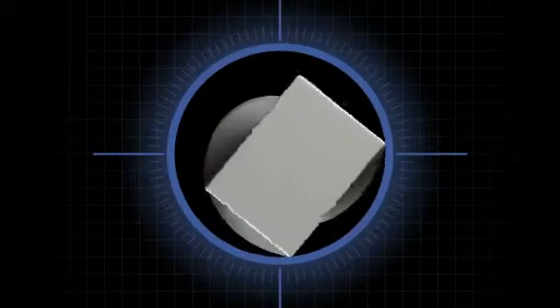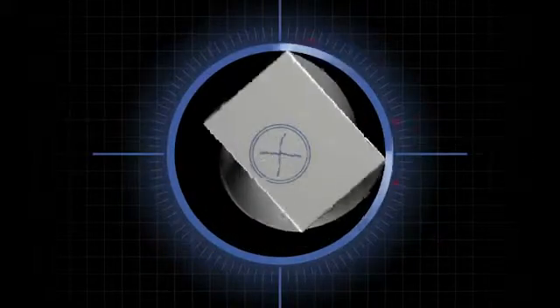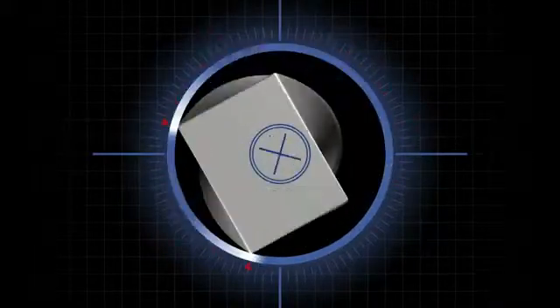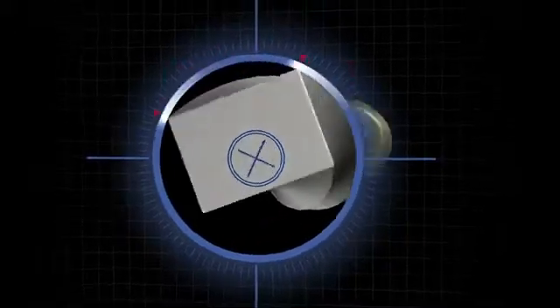Here is a closer look at the unique offset rectangular cross-section. Notice the mass of the file is offset from the center of rotation.